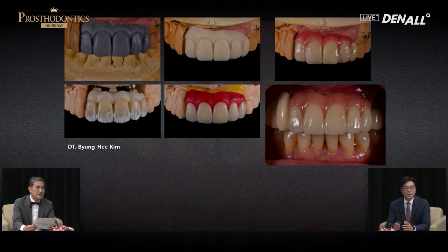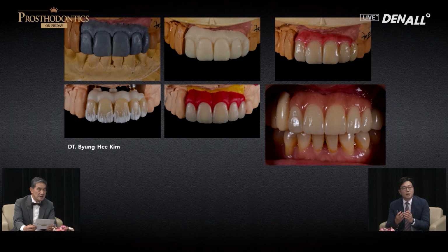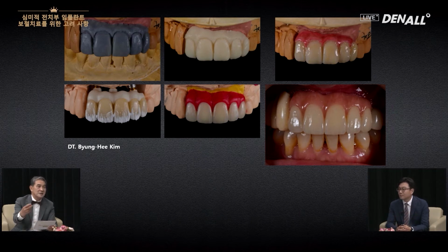Due to trauma, or there is no bone and big spaces, I use zirconia frame to restore gingiva, and crowns are made over it. Beneath the zirconia frame, you need to be able to clean the space. That should be considered in designing this. So it should be designed for cleaning purpose as well.